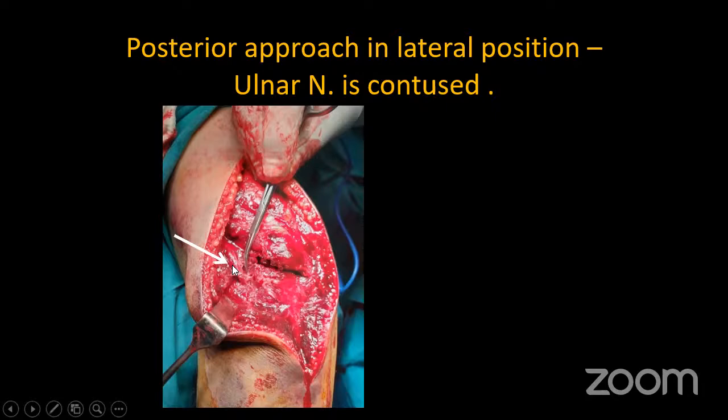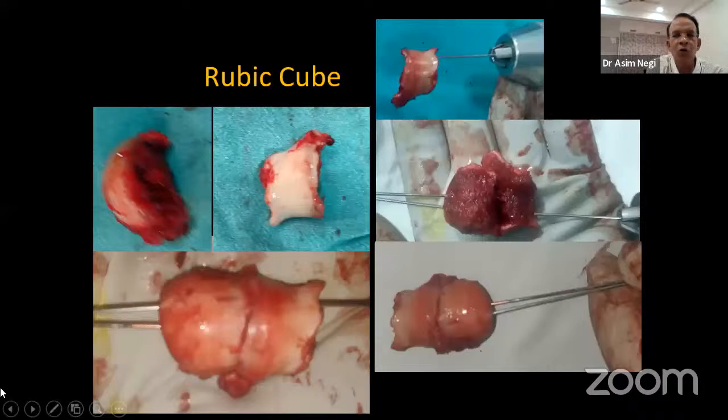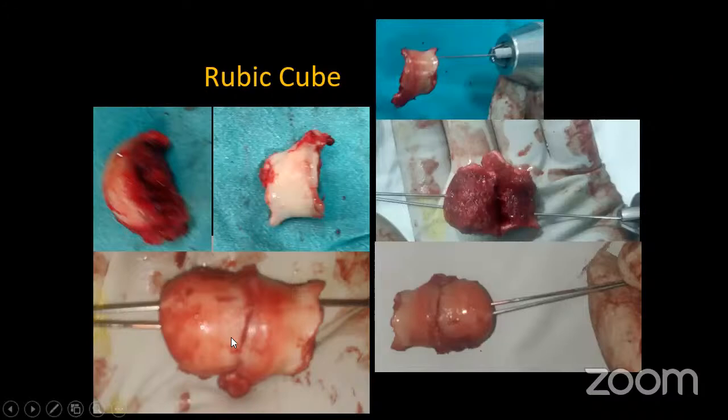You can see that there are two big pieces of lateral part of trochlea which are free. They go on the table. Then more pieces, a third piece is also there. Then three or four assistants and surgeons were trying to find out which piece will fit into which. Finally, we arranged them. This is the right trochlea, reconstructed on the table.